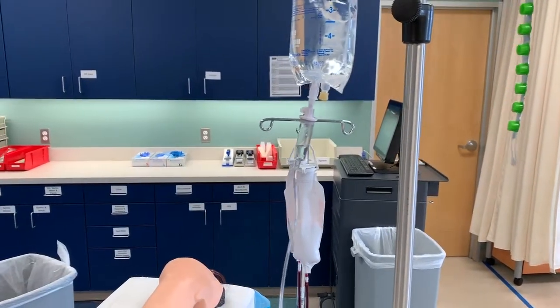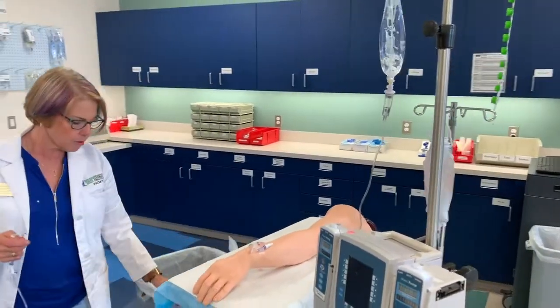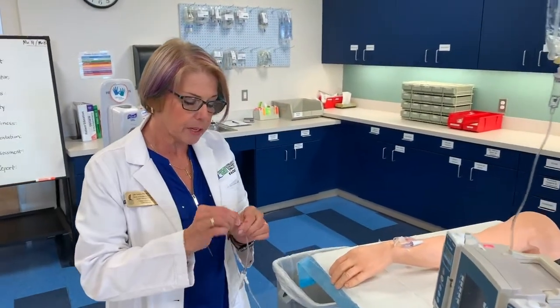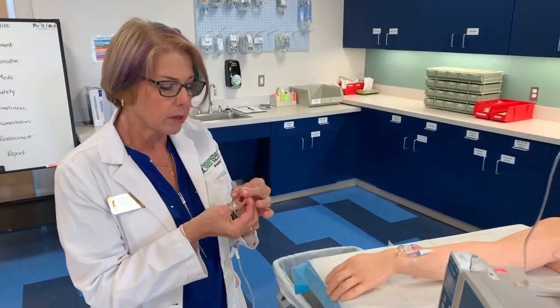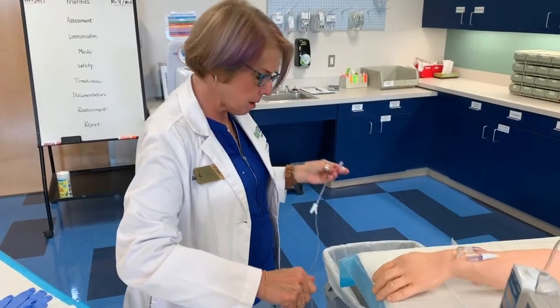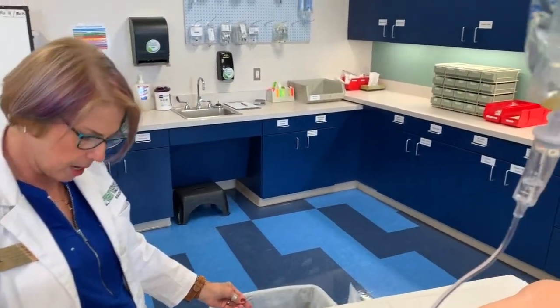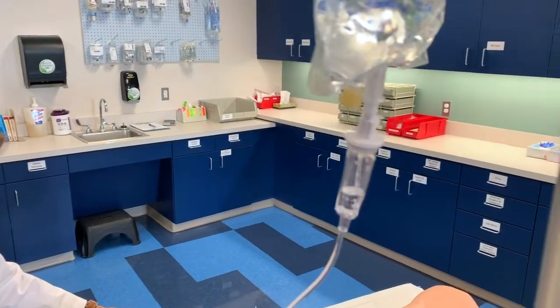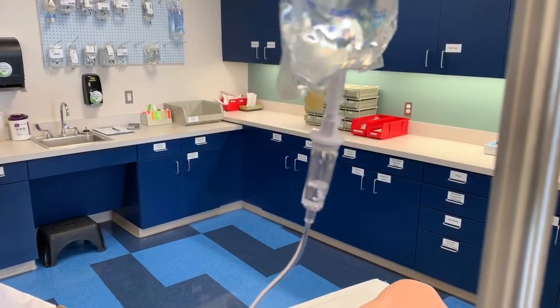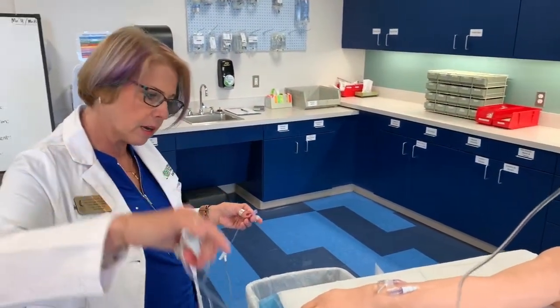Now we need to prime our fluids. I like to go ahead and bring a trash can over and very carefully open up my little cap here, maintaining sterility with that. And then go to my roller clamp and open it. Now you can see that water will come down pretty quickly. And we want to clear out the fluid until all the air bubbles are out, and then go ahead and close the clamp.